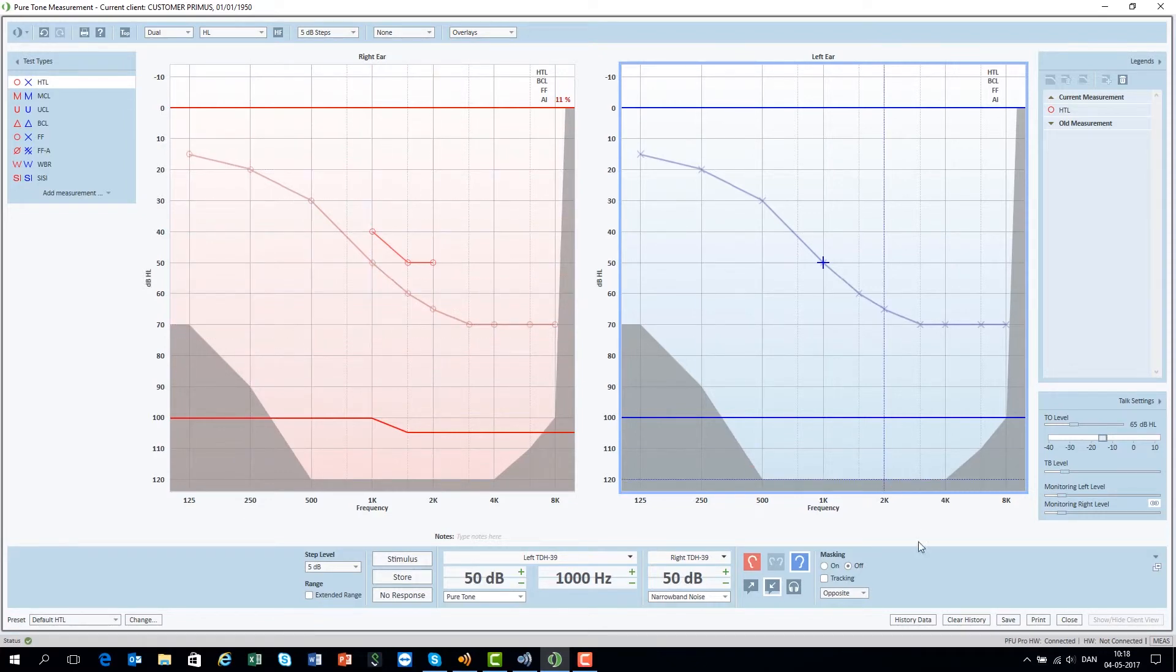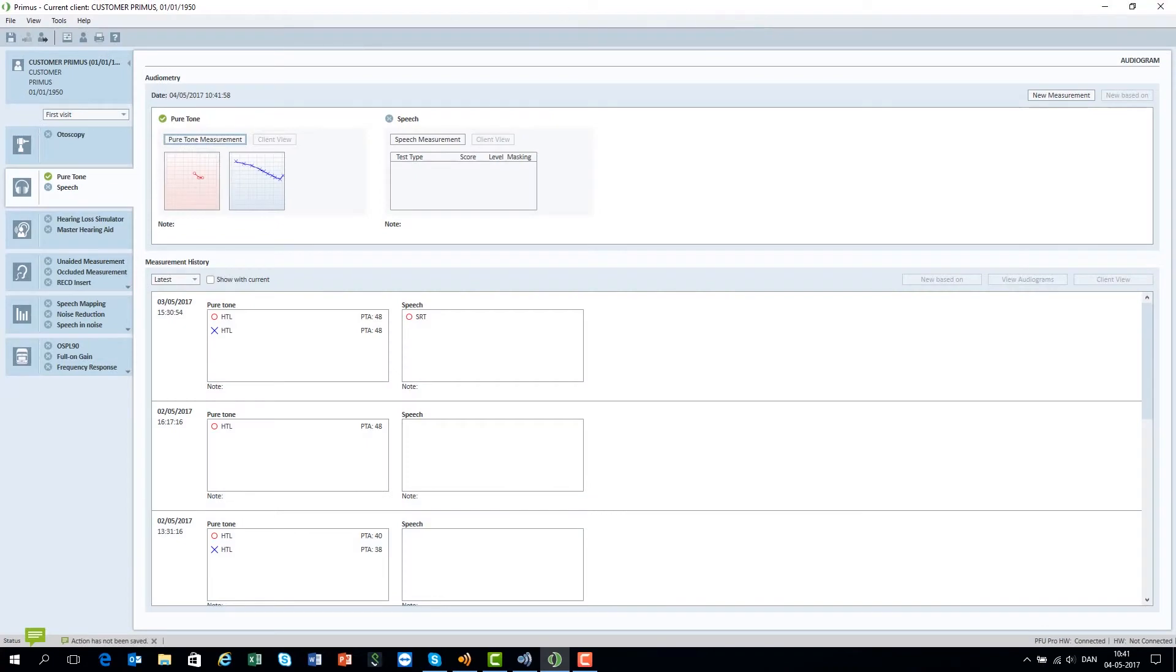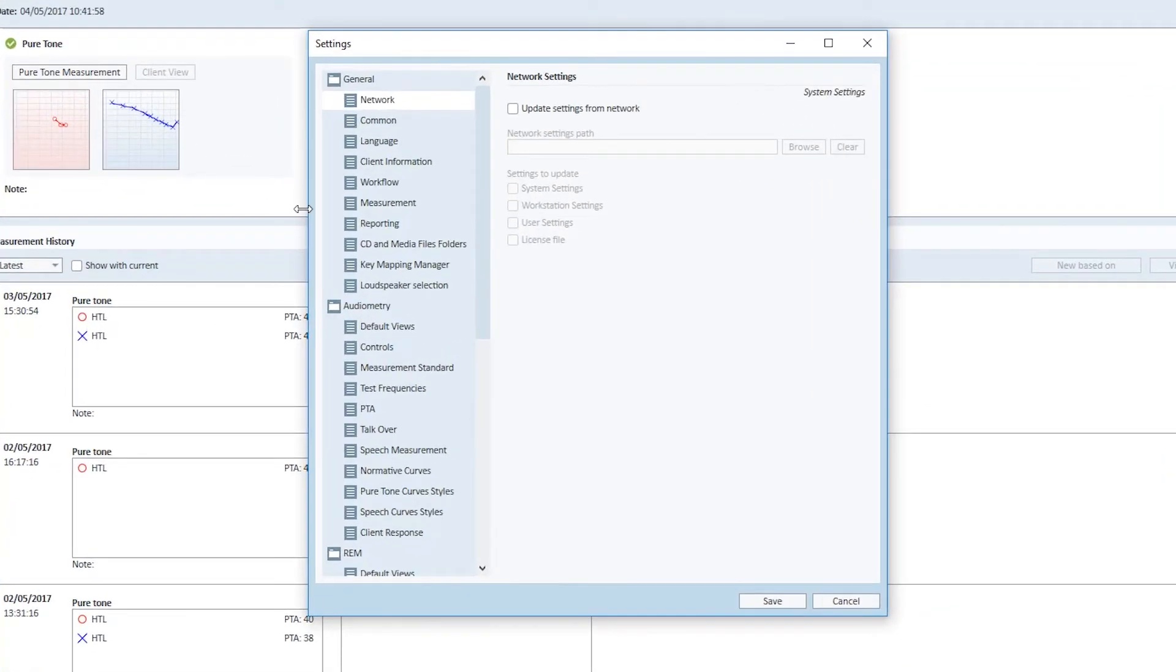Clear history will remove the previous audiogram. To configure the Primus audiometer to fit your way of working, open Tools, Settings and Audiometry Control settings.